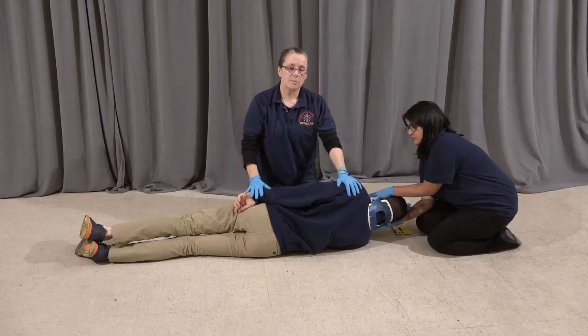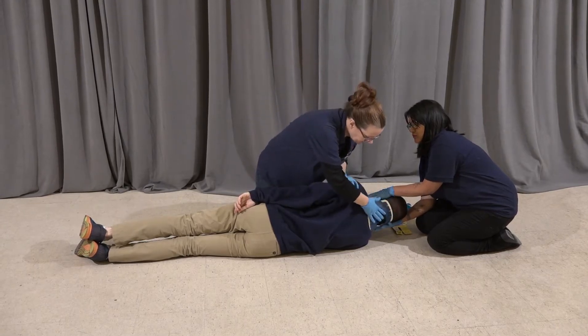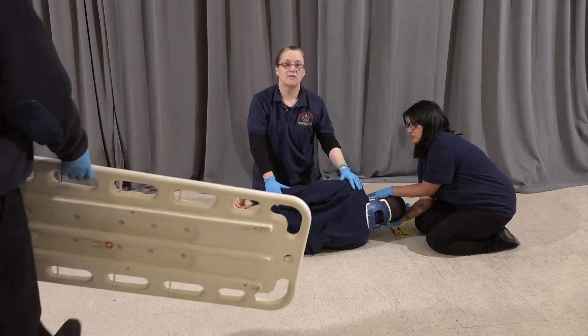While I have the patient on his side, before I apply the board, I'm going to check the posterior — back of the head, the spine, buttocks, and back of the legs. Seems to be no signs of injury here.